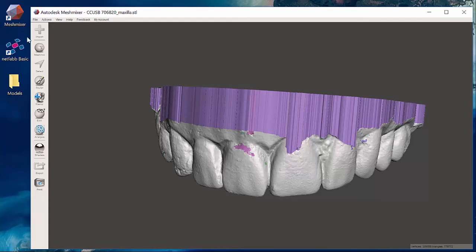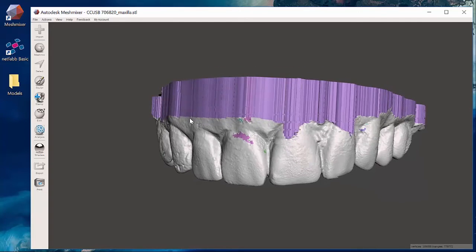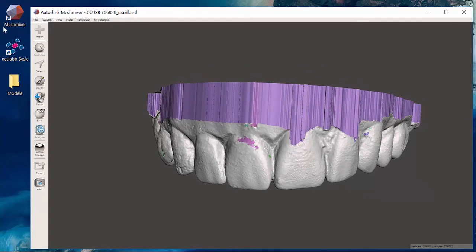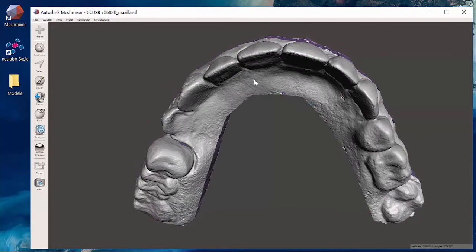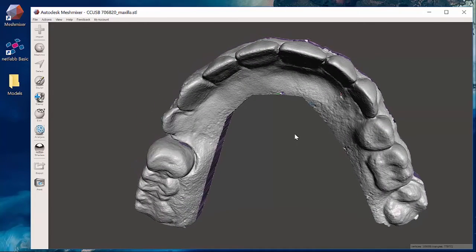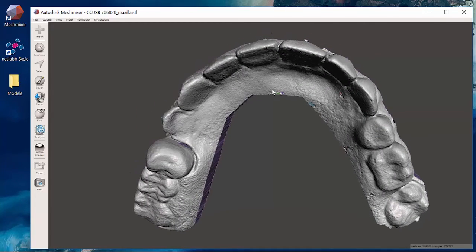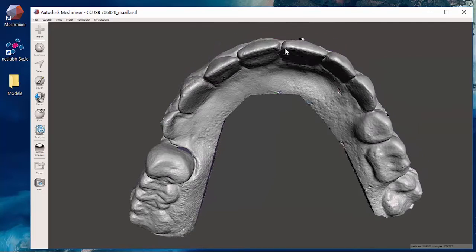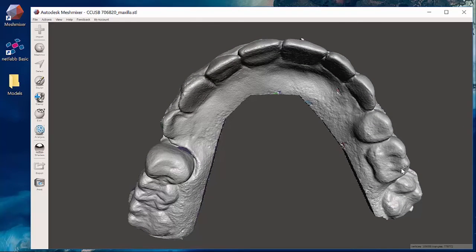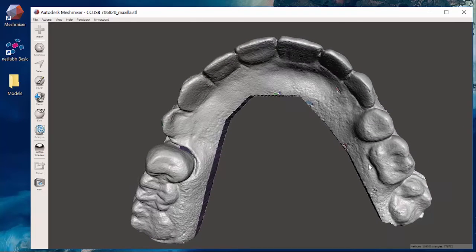If you reach a spot in the Mesh Mixer software where it just is not cooperating, try throwing it into NetFab Basic and a lot of times that fixes it. If not going with the Mesh Mixer software you should be able to find it, just takes a little bit of troubleshooting.